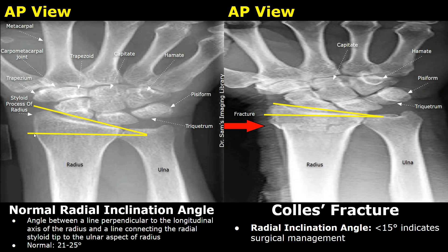An angle called the radial inclination angle is used to assess the radius and is also helpful in the management of Collis fractures — it can help determine whether surgery is required. It is the angle between a line perpendicular to the longitudinal axis of the radius and a line connecting the radial styloid tip to the ulnar aspect of the radius. Normally this angle is between 21 and 25 degrees. In a Collis fracture this angle gets reduced, and if it's below 15 degrees, surgical management is recommended.